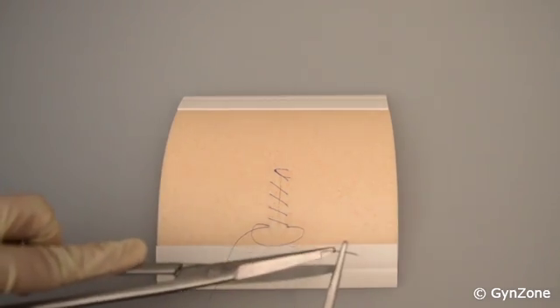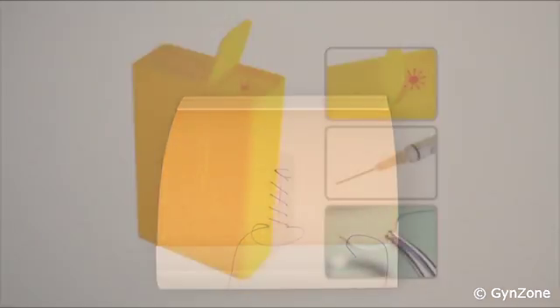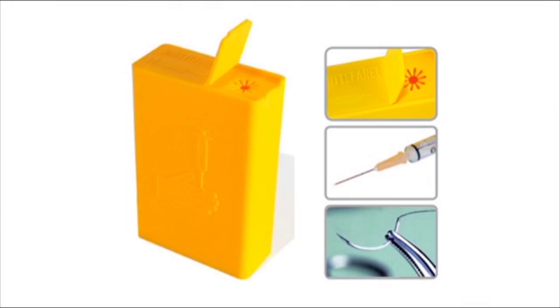If you only have enough suture material left to make a knot, simply cut off the needle to avoid needle stick injuries. Remember to dispose the needle correctly in a container for sharp disposable objects.